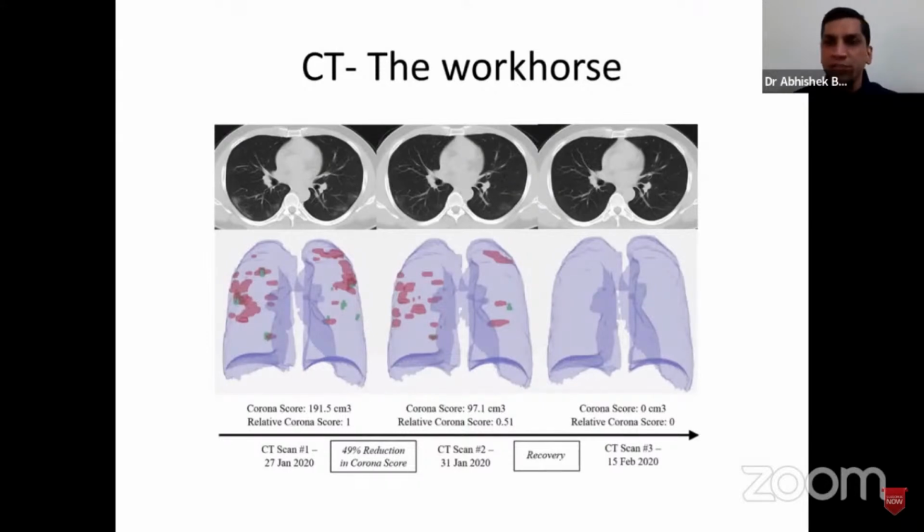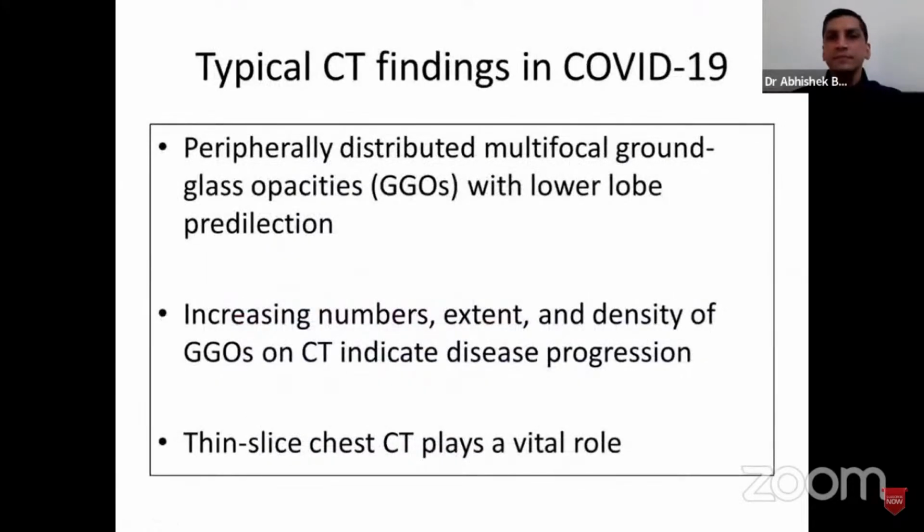And a lot of CT scoring indices came forward, we had a CT scoring as well that would actually quantify how severe the infection was. And using artificial intelligence, we can actually mark these patches, give a volumetric rendering for these patients, and actually tell the clinician, okay, this is what this patient is dealing with, and this is how you need to manage now. So that was all about how CT was helping these clinicians in managing COVID-19 patients.